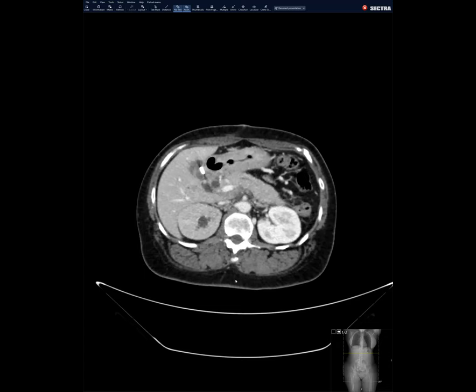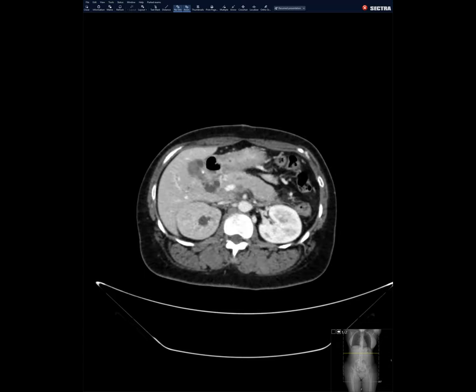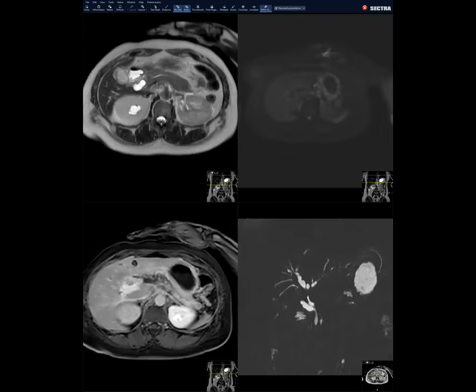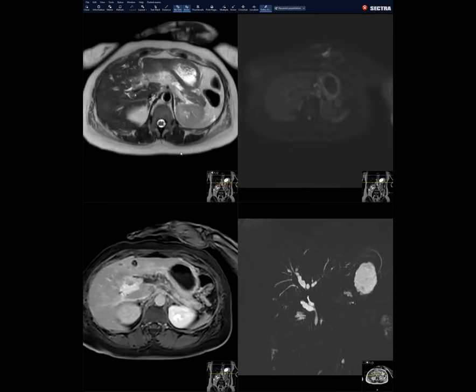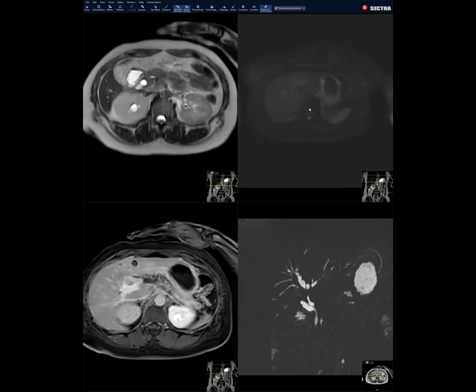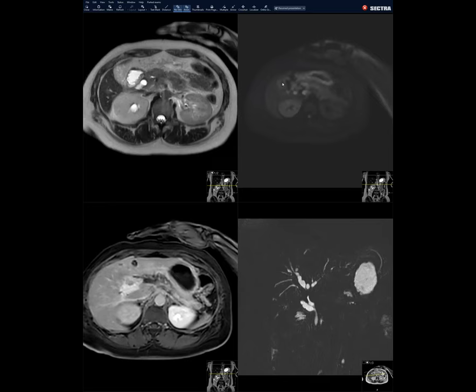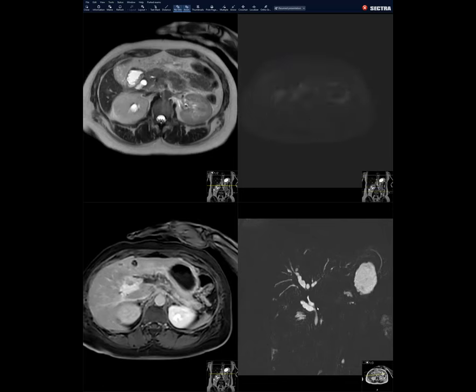We raised concerns for all this, and then at that point they went back and looked at the pathology specimen from the gallbladder — and sure enough, they confirmed there was a gallbladder carcinoma. We then did an MR to further confirm these findings. MR again showed the same findings. On diffusion-weighted images we nicely see the hilar mass, the surrounding nodes, soft tissue in the gallbladder fossa, and diffusion restriction throughout the stomach. MRCP again confirmed the same findings.